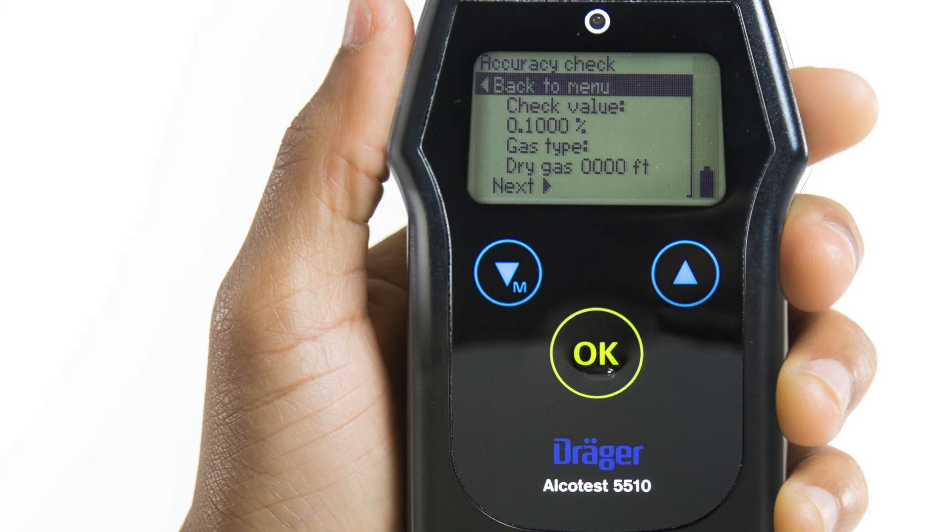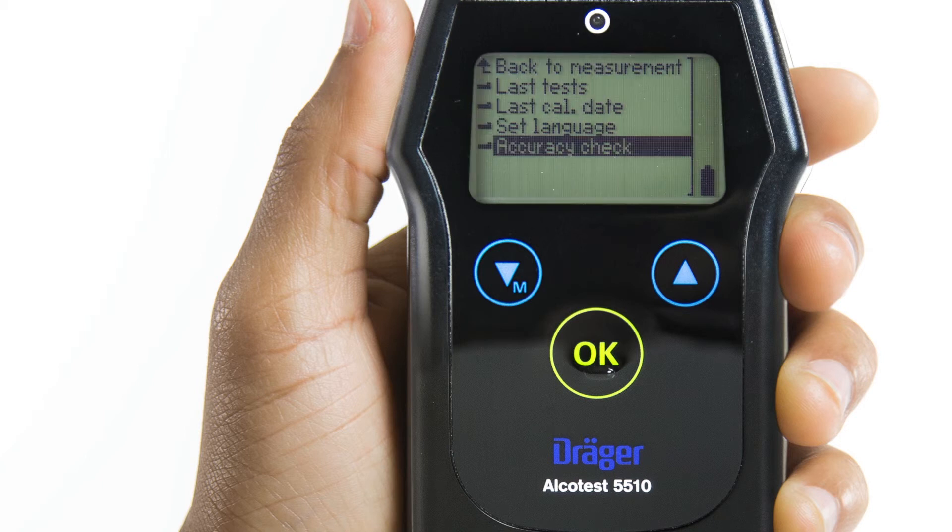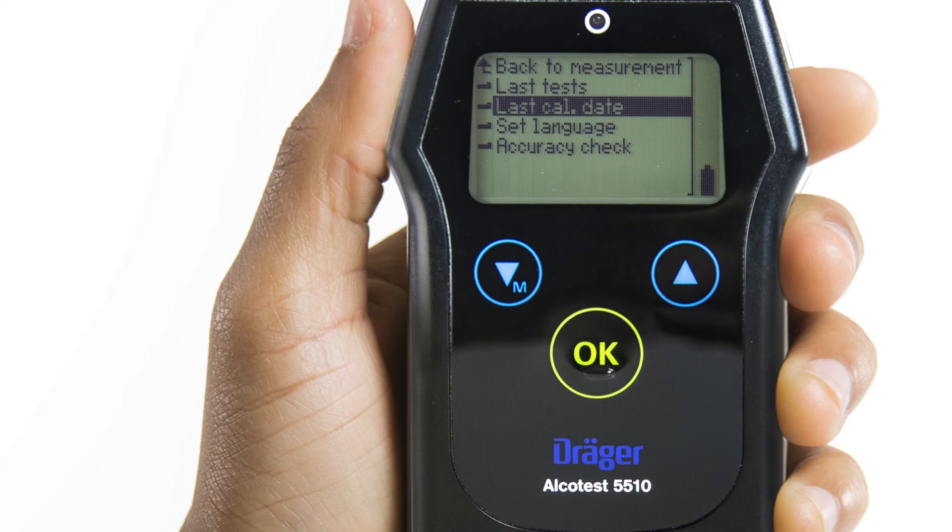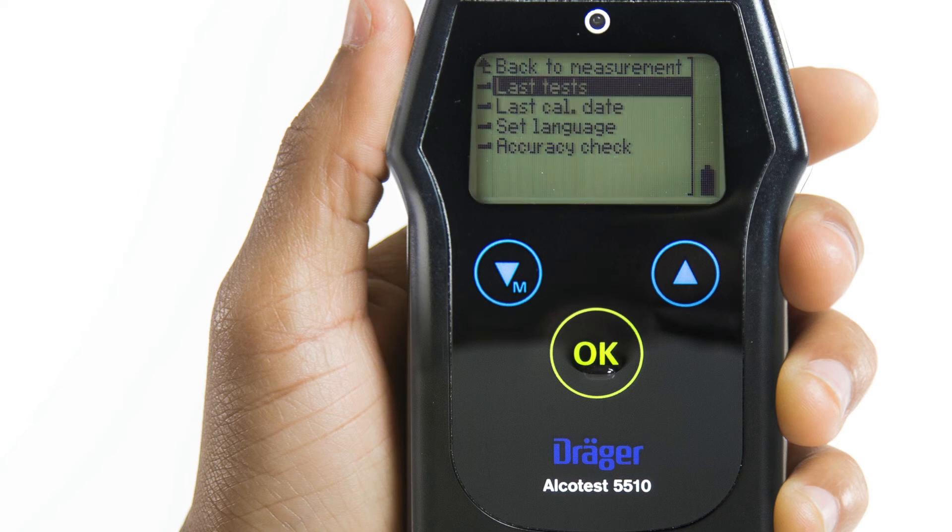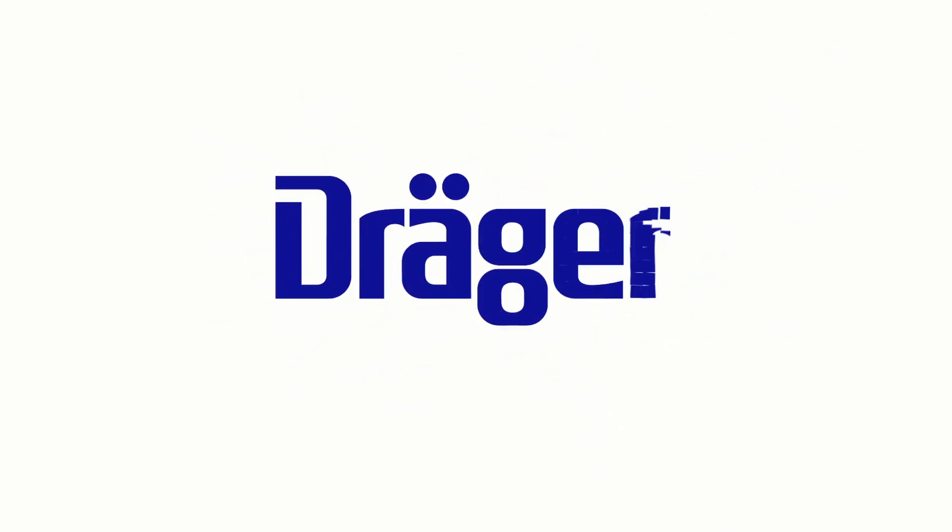We'll talk more about accuracy checks in a minute. To exit the quick menu, press the arrow up button to scroll to Back to Measurements and press OK.